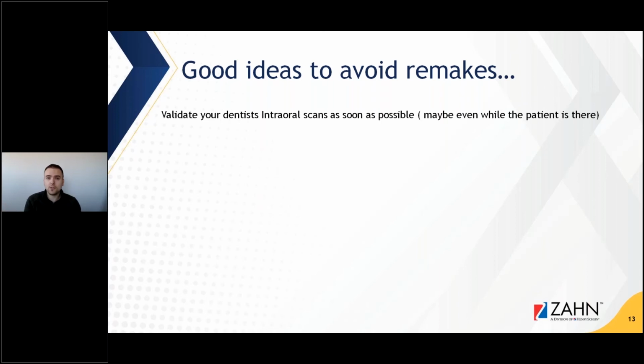Dentists don't see as many patients. And so we do cases, we're now maybe getting some cases inserted that we did back in November because the patients just weren't able to be scheduled. So having the ability to assess the quality of that scan so you don't have to reschedule a patient for another one is important.